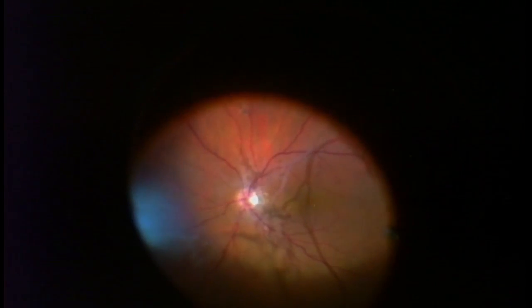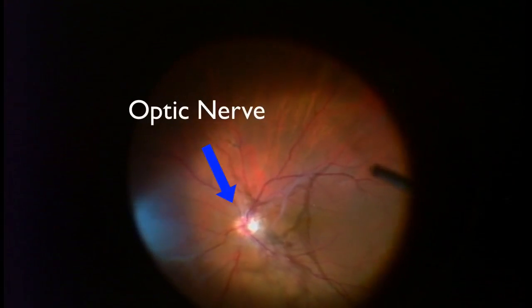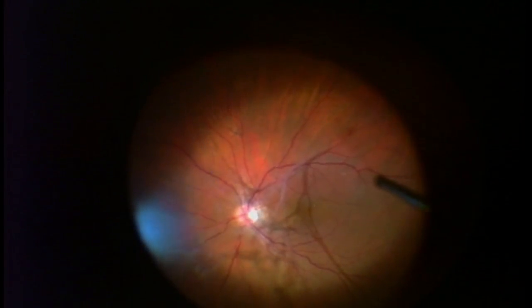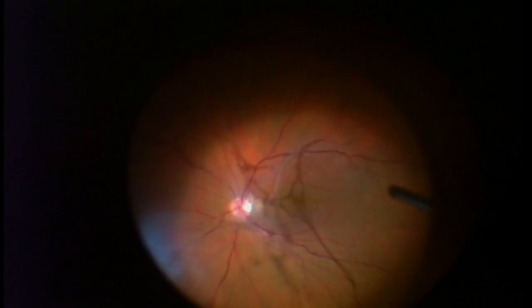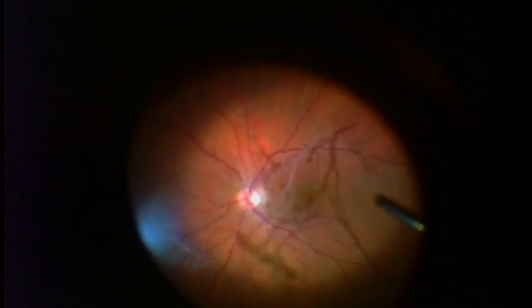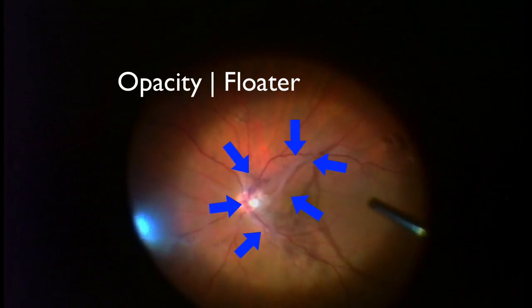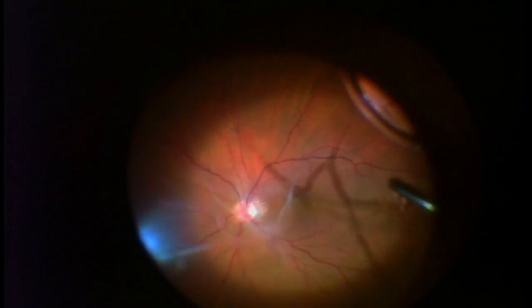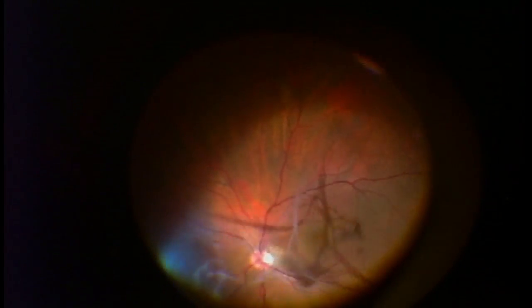And I think unlike some of the other videos, this is really self-explanatory. There's the optic nerve. And you can see the vitreous kind of swishing back and forth. And so therefore all floaters kind of have to float back and forth with eye movement. That silvery shadow in the upper right is just an air bubble.